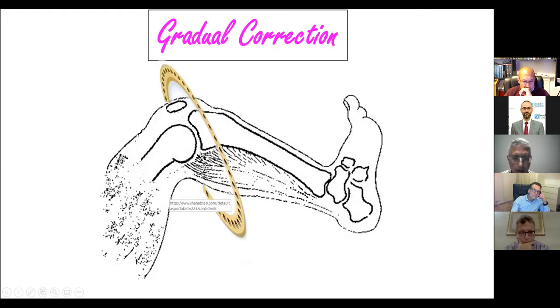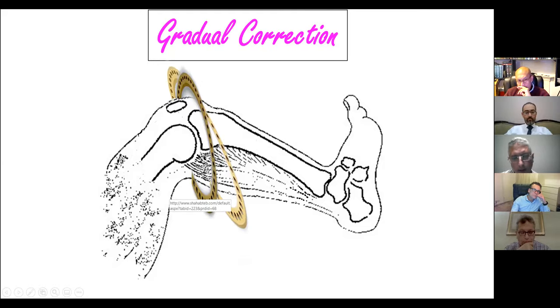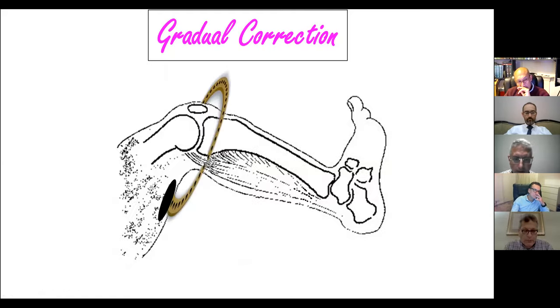The other solution is to use a larger ring. However, this reduces significantly the stability of the frame. There's another solution, where we use an undercorrection of this deformity to use the proper size of the ring and to allow clearance of the soft tissues between the skin and the ring. However, with gradual correction of the deformity, it will impinge again against the back of the thigh, preventing the range of motion and limiting any further correction of deformity.